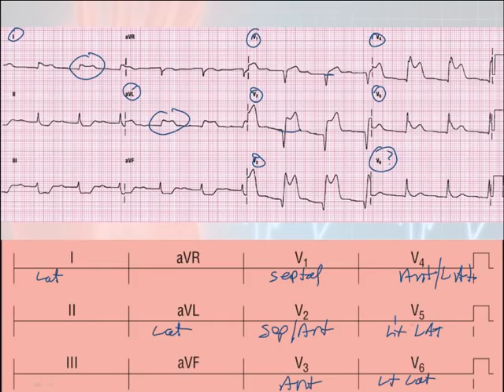The next question is, how do you document something like this? How do you document that the person is having all of this stuff going on? It kind of depends. I've read a couple different things. You're supposed to do it alphabetically, or you do it by the most elevation somewhere. I haven't found it. If anyone finds out the real answer, please let me know so I can make sure I put that out in information.